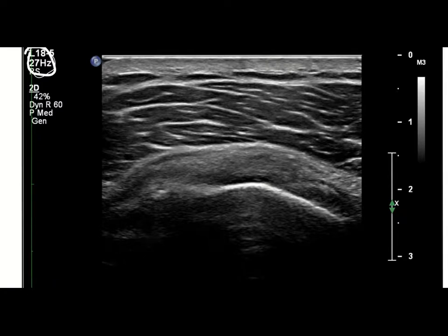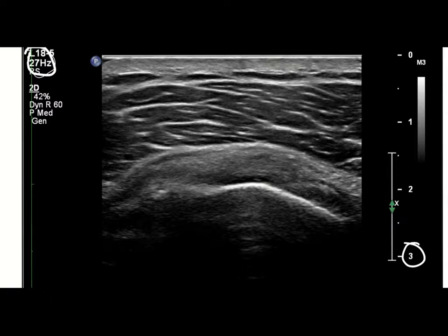For this particular injection I like to use a reasonably high frequency transducer. You can get away with down to about 12 megahertz or so, but I like to use the 18.5 that I have. We're quite superficial — you can see that in this fairly muscular individual we're only down to three centimeters at most.